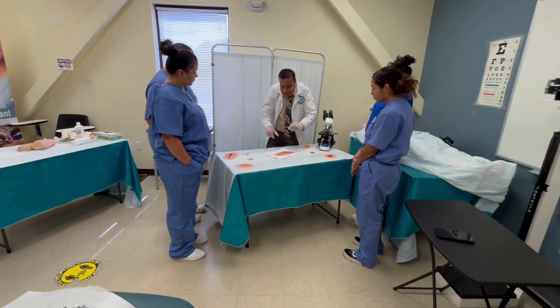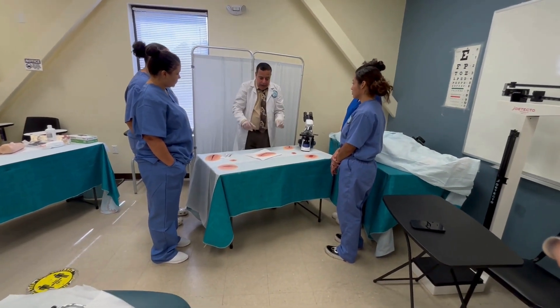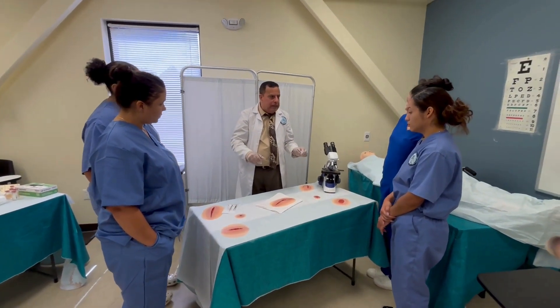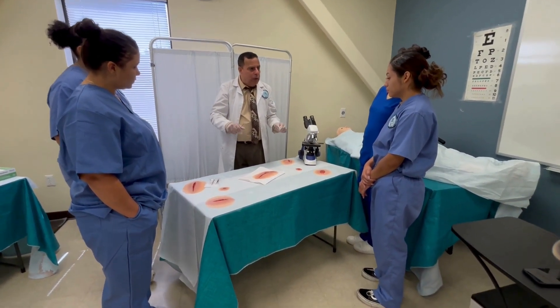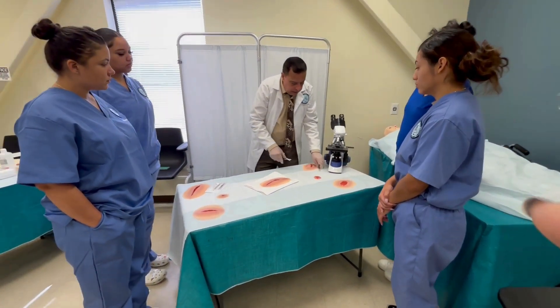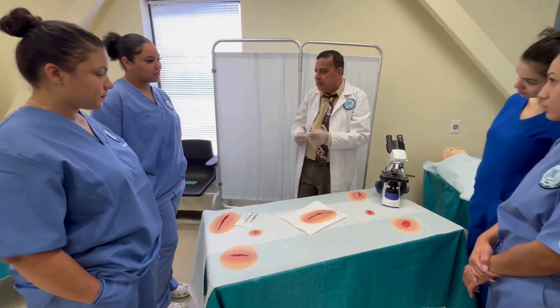Do I have to suture the patient? No, that is outside our scope of practice. But I am qualified to remove sutures. Now I need someone to practice how to remove a suture.